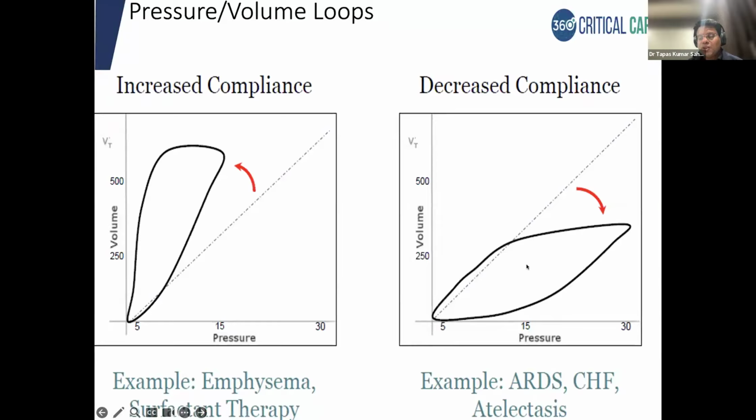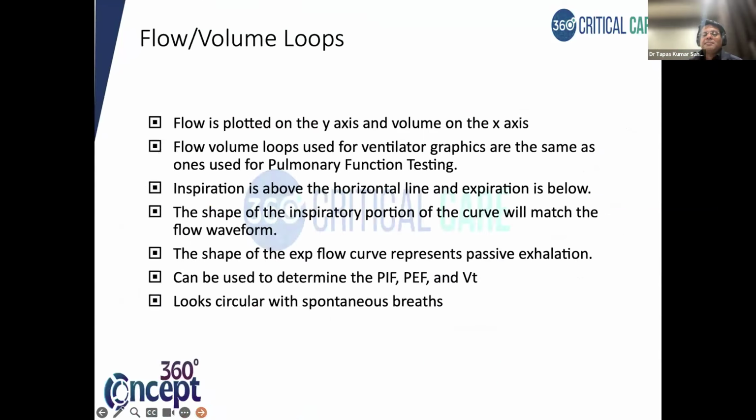Now, if you are doing some maneuver and you are treating the patient with low tidal volume ventilation with adequate PEEP, then maybe next day, at 24 hours, 48 hours, you can see this loop which was tilting towards the right side going again towards the middle, in the center. So that means your treatment protocol is working.